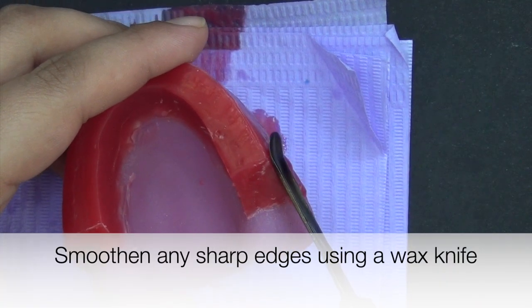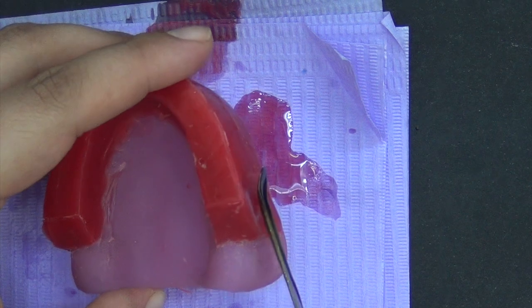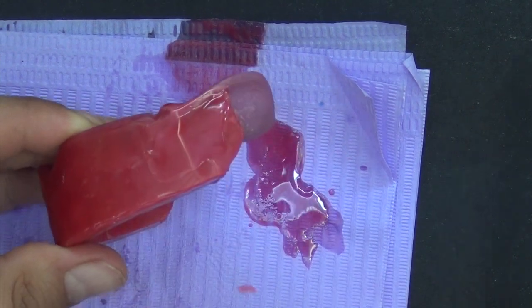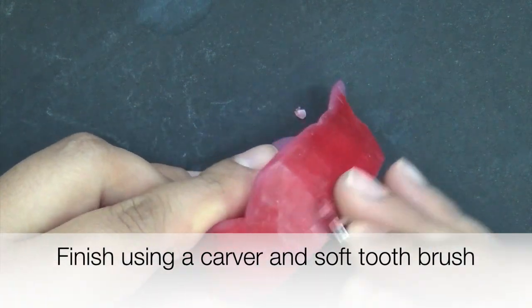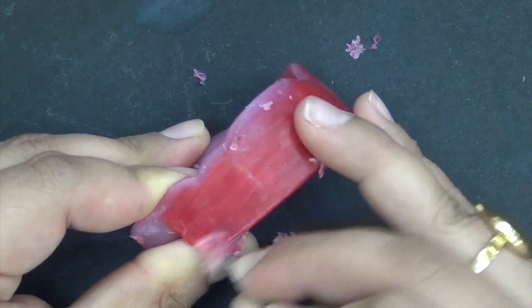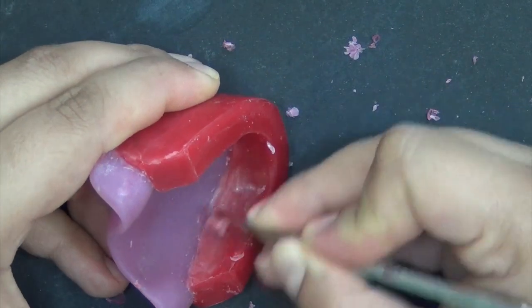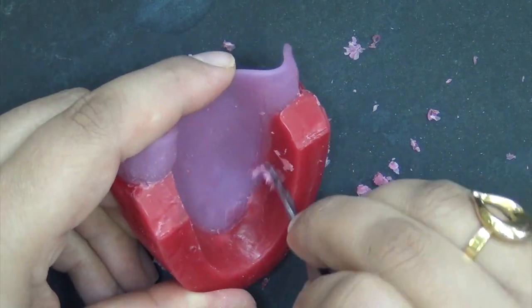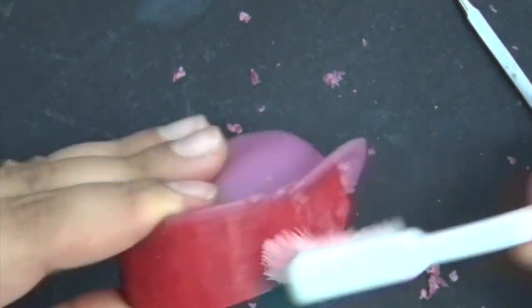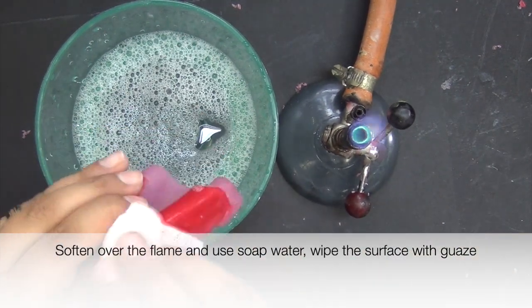Smoothen sharp edges using a wax knife. For a nice glossy finish of the wax, use a carver to remove all excess and to remove all sharp edges from the wax rim, and then followed by brushing it with a soft toothbrush. Soften the wax rim over the flame and use soap water to clean the surface. When finished, wipe it with a piece of gauze.